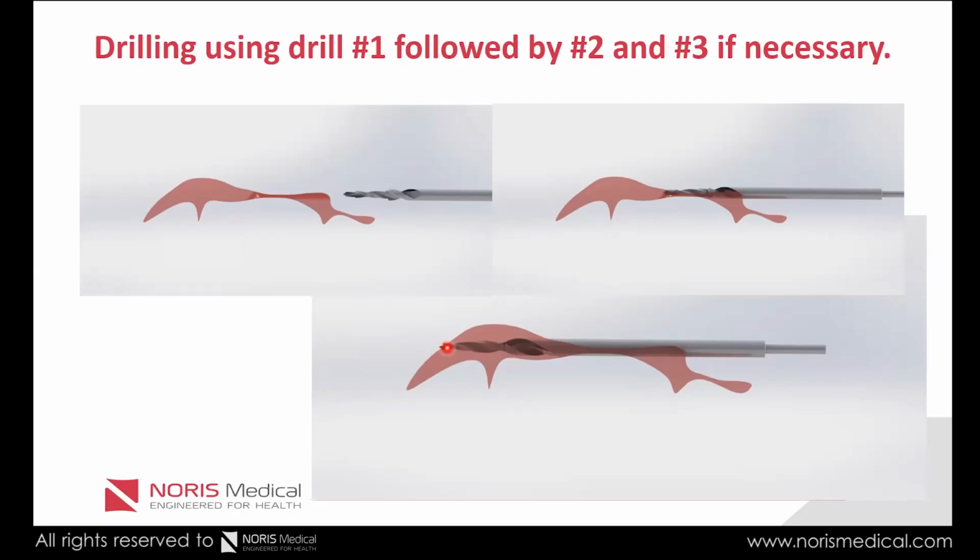Another reason we want to perforate the bone is we want to make sure that we are using the longest implant possible for this case. Because if we did not perforate and for some reason we stopped here, we would be using a shorter implant. And in this case, shorter implant is not what we want. We want to have the longest implant to come and be anchored on the cortical bone here. Okay, so this is a very important point.